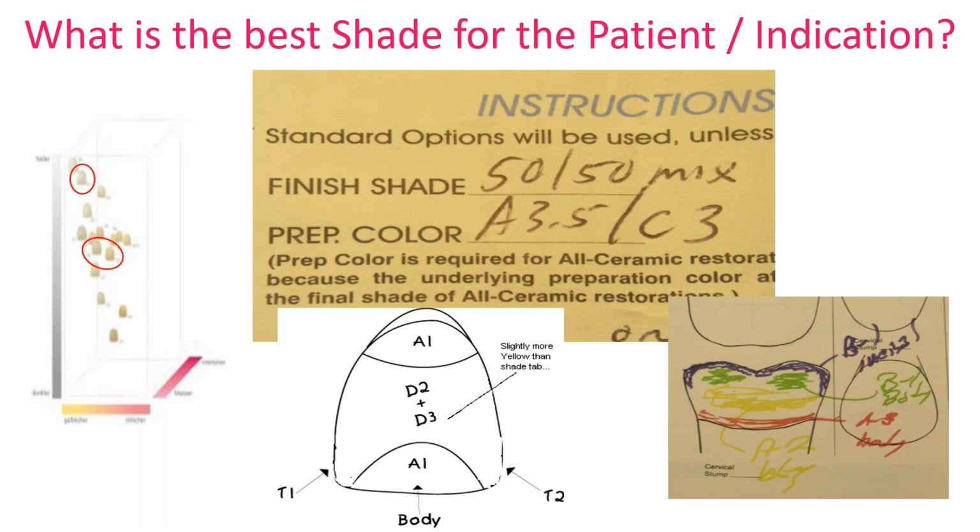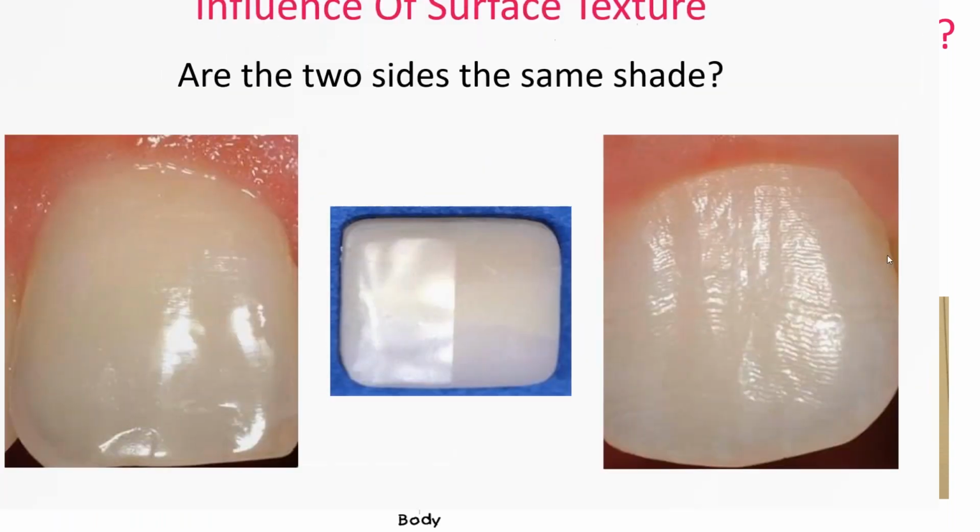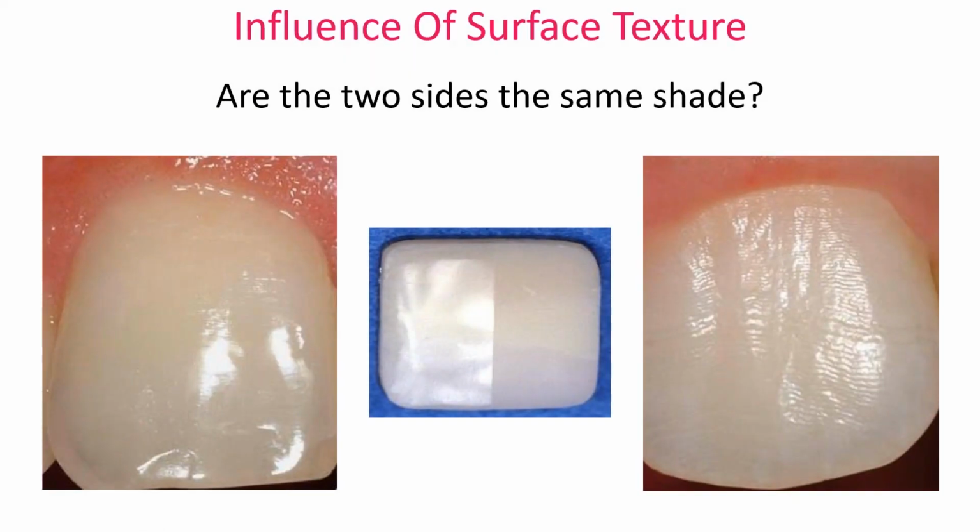So you need to start filling in that gap, that shade gap. You need to start providing information that expands your shade range, that actually incorporates other possible shades as the closest match to that natural shade. So prescriptions are great, but we need pictures. We also need the photographs.